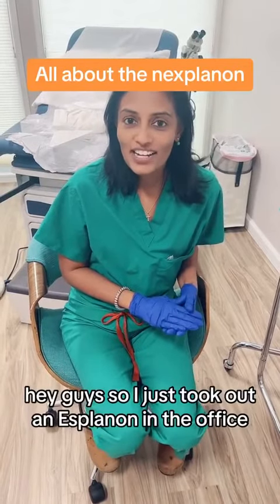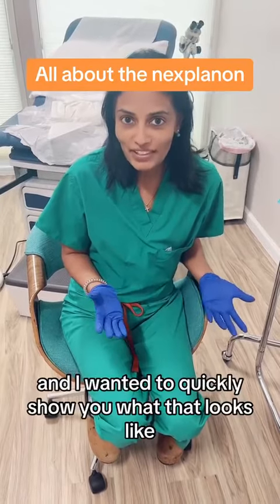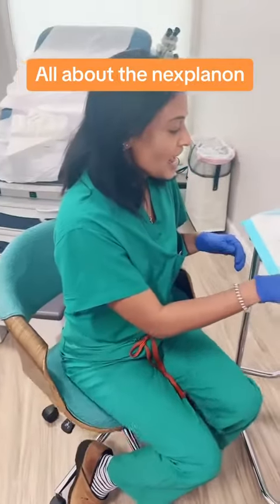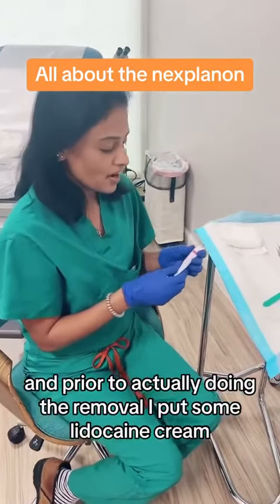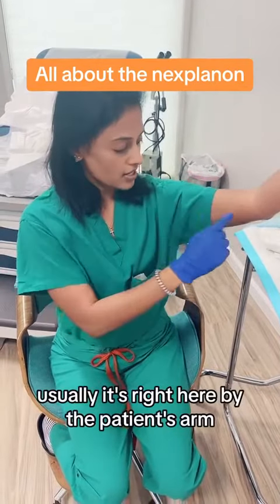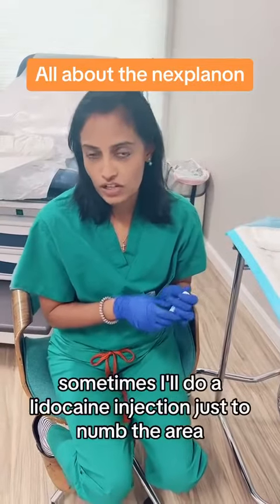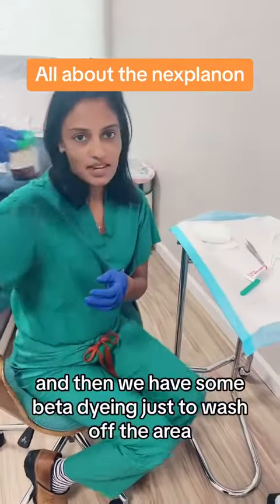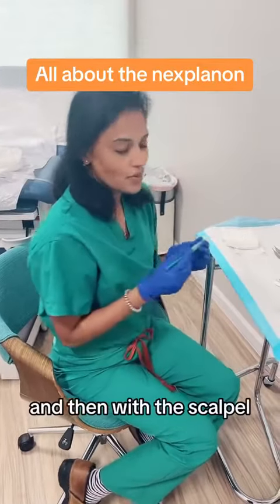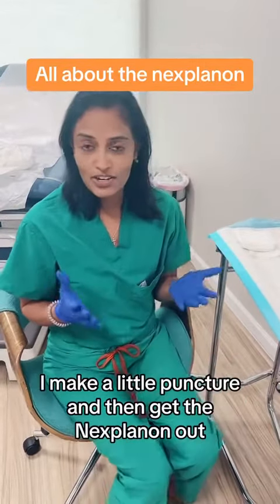Hey guys, so I just took out a Nexplanon in the office and I wanted to quickly show you what that looks like. All you need for a Nexplanon removal is a scalpel, and prior to actually doing the removal, I put some lidocaine cream. Usually it's right here by the patient's arm. Sometimes I'll do a lidocaine injection just to numb the area, and then we have some betadine just to wash off the area. Then with the scalpel, I make a little puncture and then get the Nexplanon out.